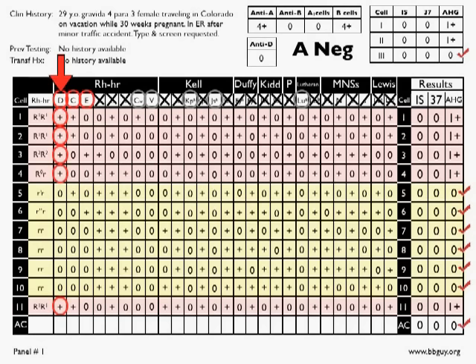First one is big D. And not surprisingly to most of you, I'm sure, every place big D is present, there's a reaction. Every place big D is absent, there's no reaction. This is a great fit for an anti-big D by itself. But let's look at the other ones.